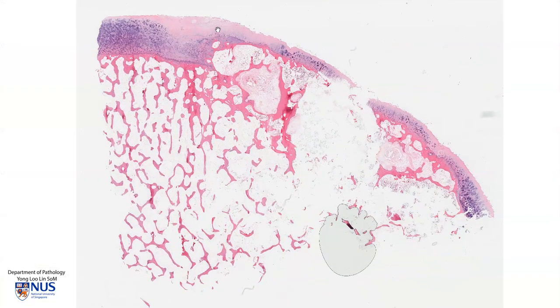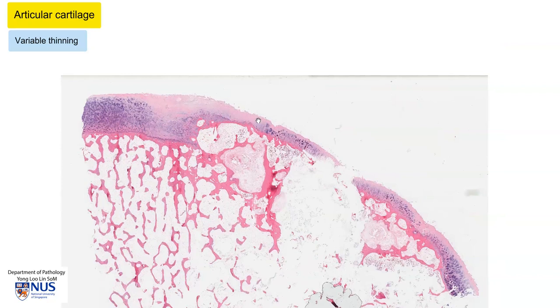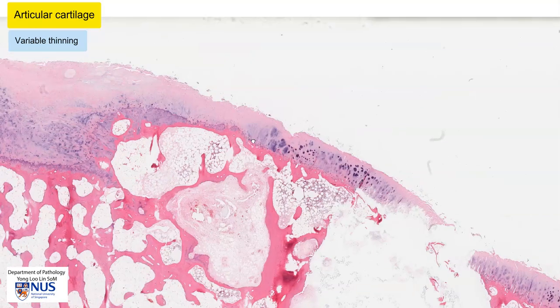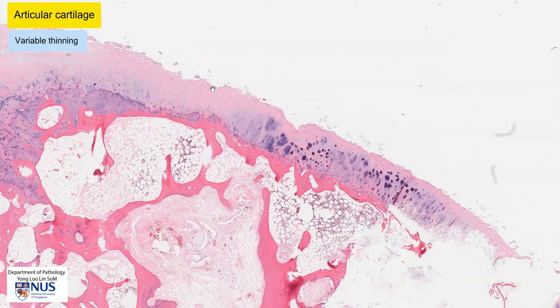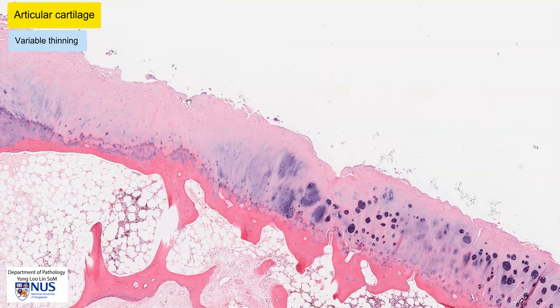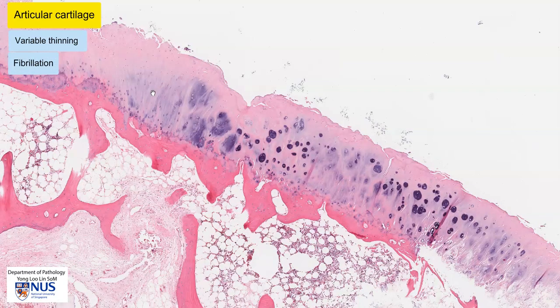Looking at the articular cartilage, we can see that the thickness is quite variable and there is some thinning in areas. This is best appreciated at this low magnification. If we zoom in a little bit, we can also see that the articular surface is quite irregular. There appear to be some cracks or fissures at the articular surface, and this is known as fibrillation of the articular surface. This is a feature of osteoarthritis.